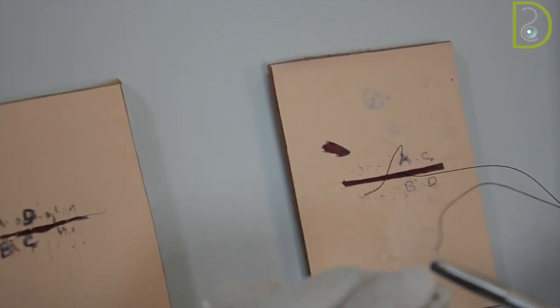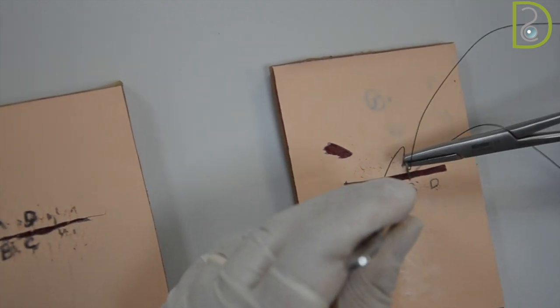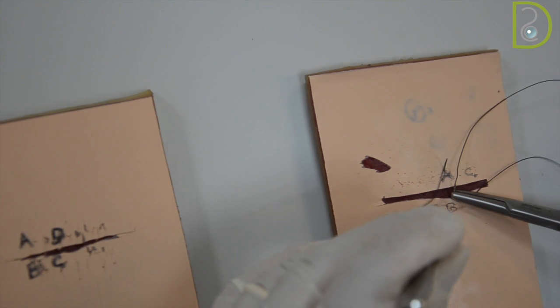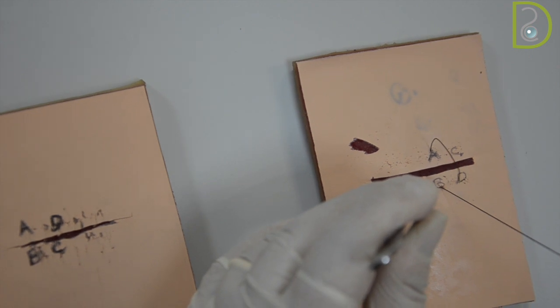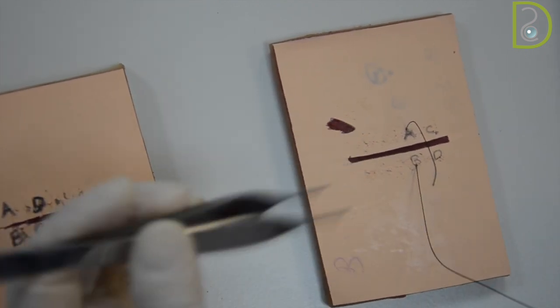Keep a little bit of the tail so that not the whole suture will go through. Then continue again grasping from the tip, going towards the palatal surface or the lingual surface if you're working in the lower, and taking it away. That's A to B, or buccal-lingual surface.